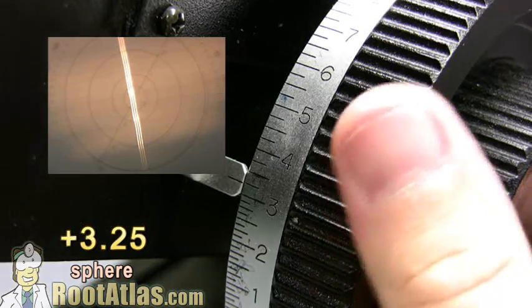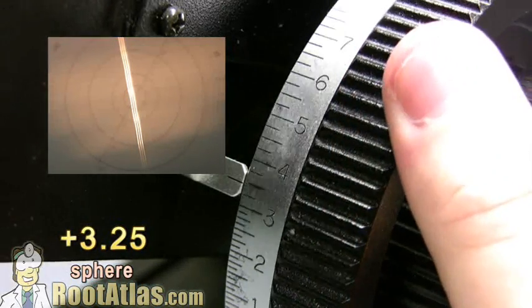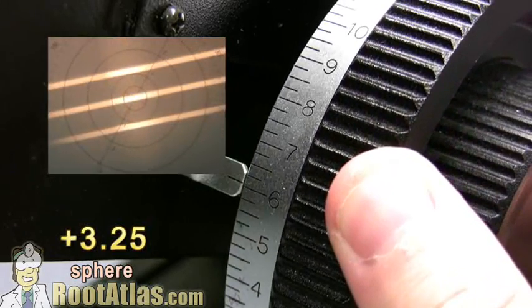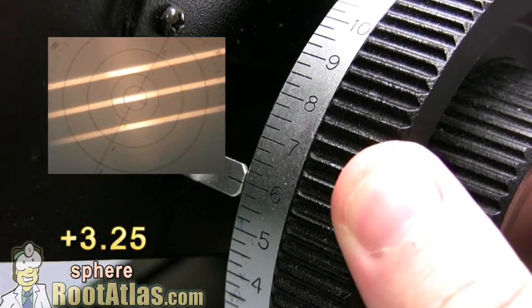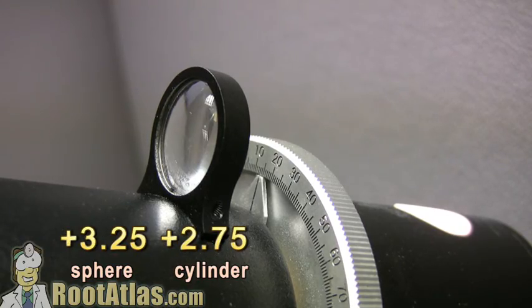Now you move the focus in whatever direction it takes to get the three fat lines in focus, and the difference between those is your cylinder power. So we went up plus 2.75 to get to 6. That's our cylinder: plus 2.75.